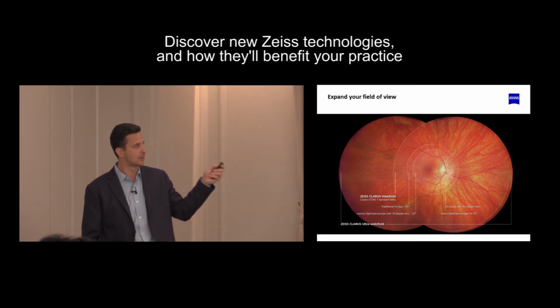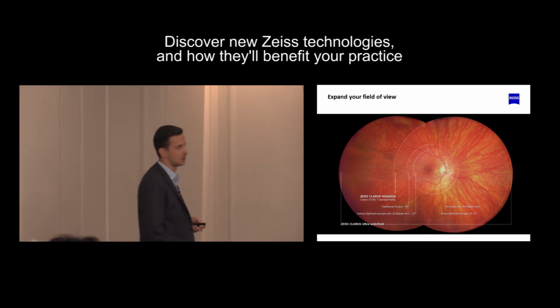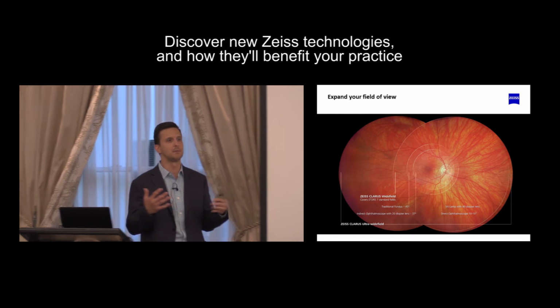I think that's really a critical piece about this, is this is as good as any fundus photography. And we'll talk a little bit about the color and those comparisons, but even at that, it's a true color. So it's got a couple of benefits in terms of being able to use the Clarus. You can actually use the Clarus in a few different modes.